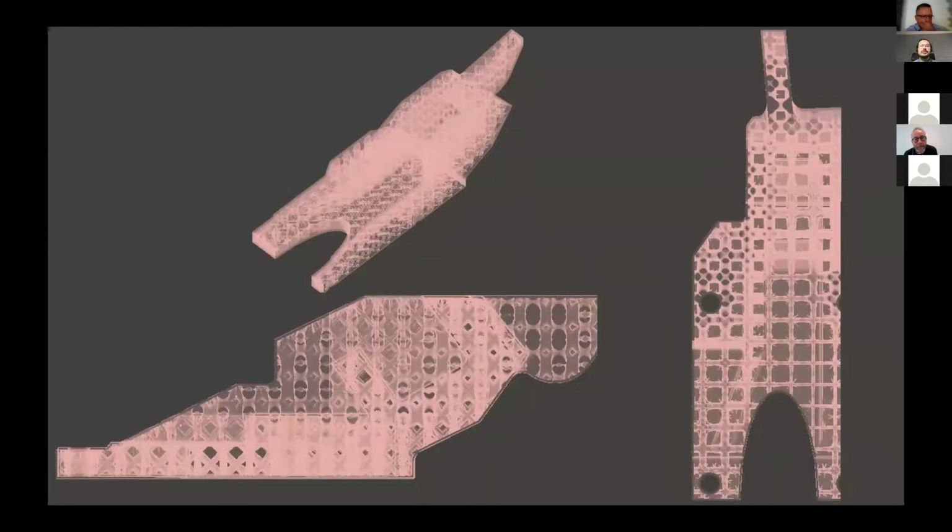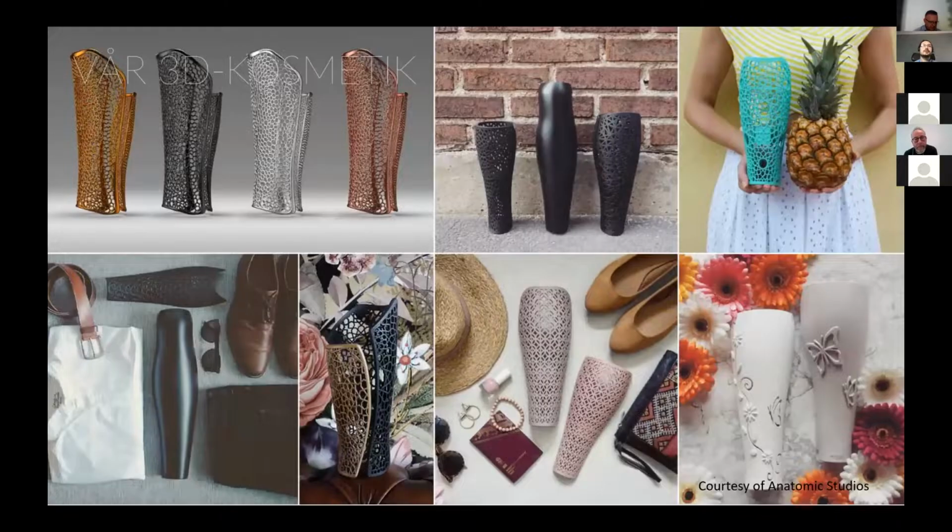But I also deal quite a bit with topology optimization, especially in conjunction with additive manufacturing and the various aspects and constraints that come with it. But today's topic is going to be on mass customization, and in particular prosthetics or cosmetic coverings for prosthetics, as you are shown here on the pages.